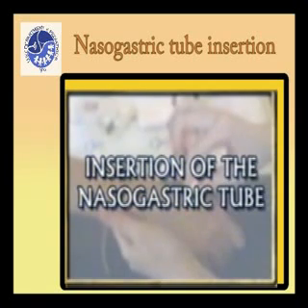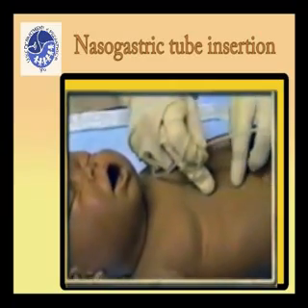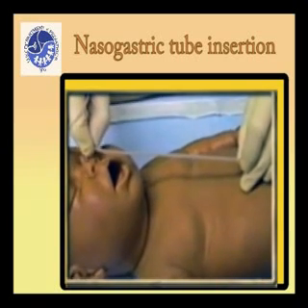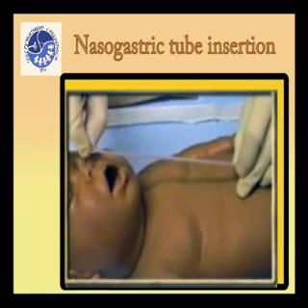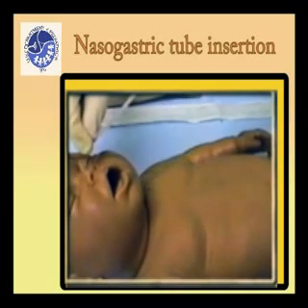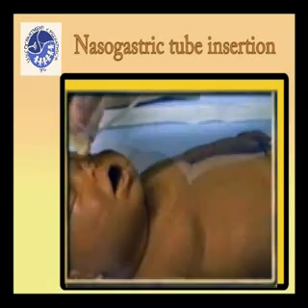Here are the steps on how to insert a nasogastric tube. Place the terminal end of the selected nasogastric tube 5 to 8 centimeters below the xiphoid process and measure to the patient's nares. This point is marked on the tube with crayon or tape and represents the length of tubing required to enter the stomach.